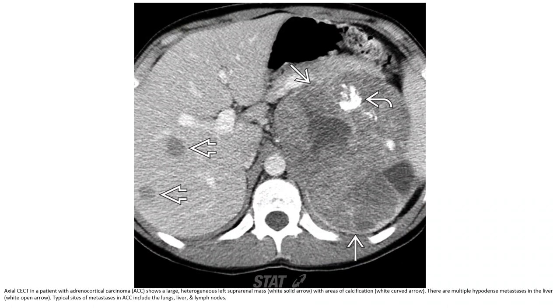Contrast-enhanced CT in a patient with adrenocortical carcinoma showing a large heterogeneous left suprarenal mass with areas of calcification. There are multiple hypodense metastases in the liver. Typical sites of metastasis in ACC include the lung, liver, and lymph nodes.